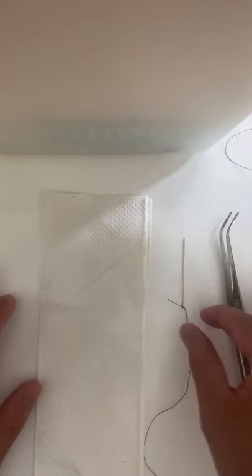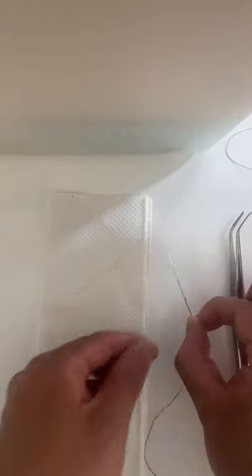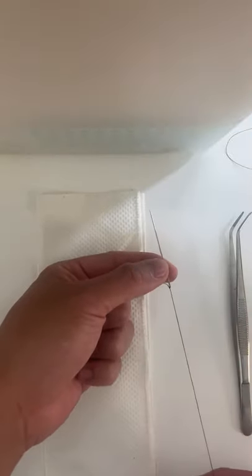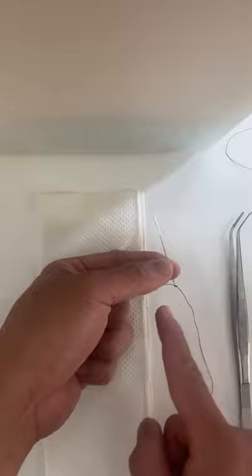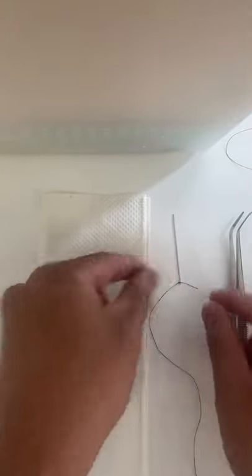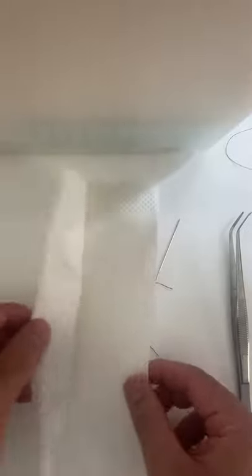I'm going to show you how to do a continuous running suture with your at-home supplies. All you need is a needle holder — I just tied a string to it and double knotted it here, leaving a little bit of slack so it doesn't get in my way. I'm going to use a paper towel, and we're going to pretend we're going to connect these two halves together.